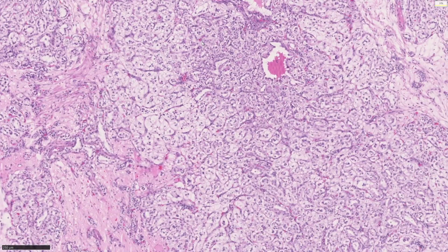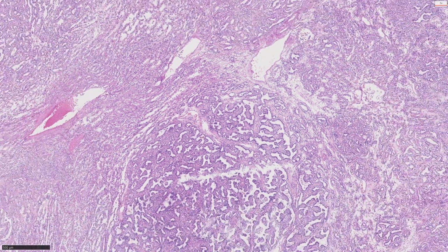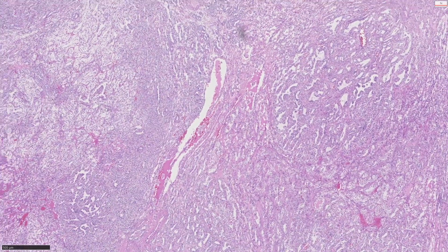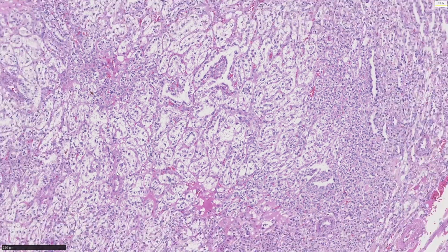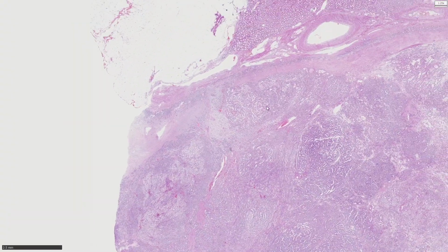Well, in fact, it's a combination of microscopic findings and immunoprofile of tumor cells. Microscopically, we will need clear cells to begin with. They should be low-grade, and this is important. And the nuclei are uniquely arranged in a linear fashion. This last bit is the one feature that will make you think of this entity at first glance. Once we have the microscopic features, doing immunostains will be the next step to confirm or rule out the diagnosis.